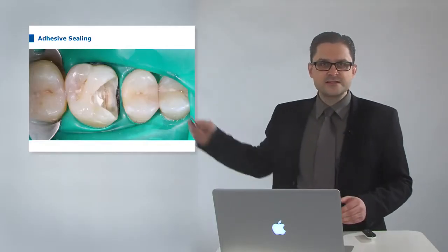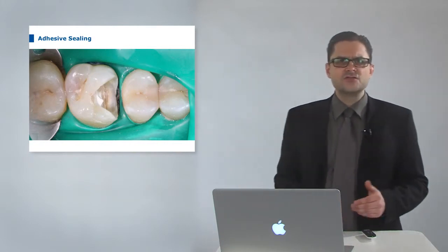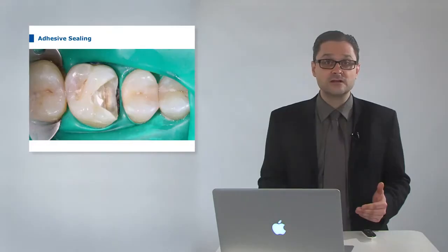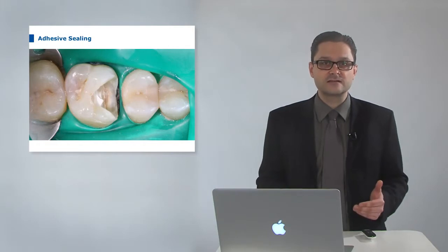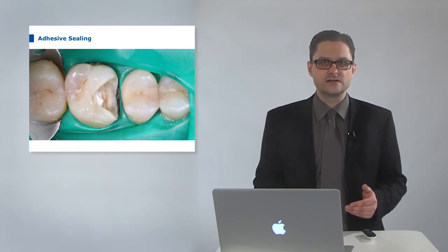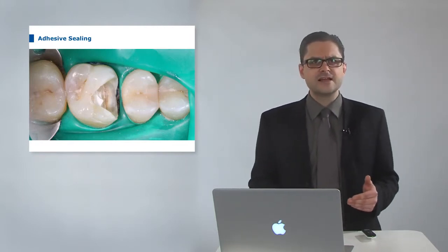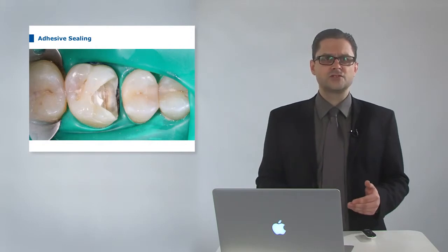So here you can see an irreversibly infected tooth clinically. The mesial caries has been excavated, so to say removed with a burr, and a rubber dam is placed. The rubber dam is very important for endodontic treatments. It provides a dry working field, a good visibility, and avoids reinfection. Gingiva and mouth are protected from the disinfection chemicals. Instruments cannot be aspirated. A provisional filling is left as a placeholder over the pulp chamber.